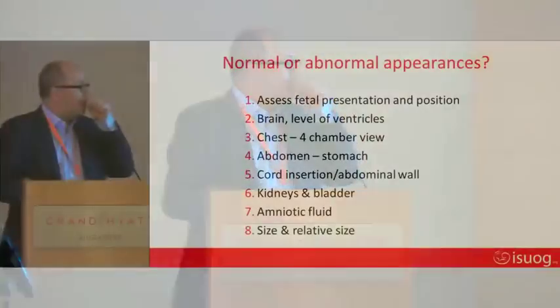So the BPD does show more variability. And because of that, we are trying to encourage people to move away from BPD and towards head circumference, for the EFW too. Correct, not to include BPD. But BPD has been such an established measurement for so many years, for so many people, which is why it's still being used. But I think it's a good idea to move towards head circumference, because the head circumference is less affected by positional aspects of the baby and by amniotic fluid differences also.